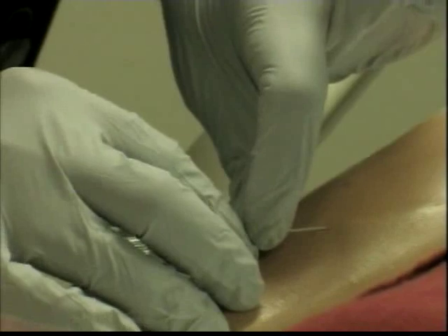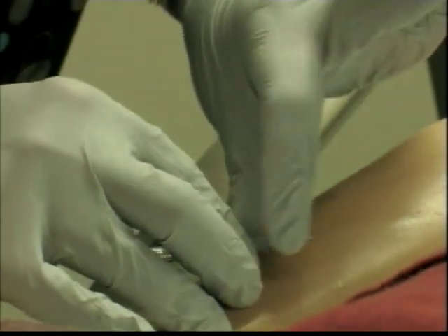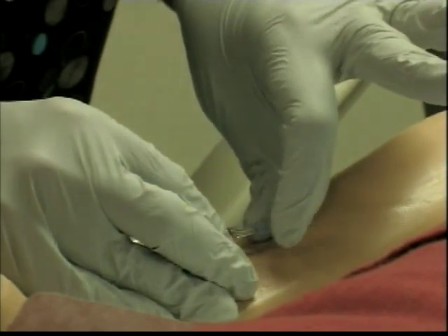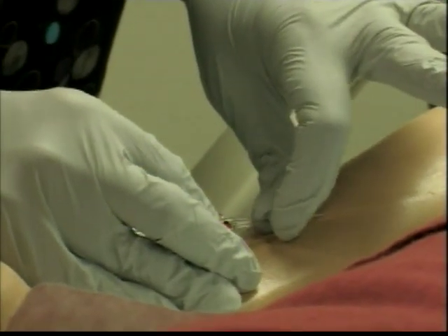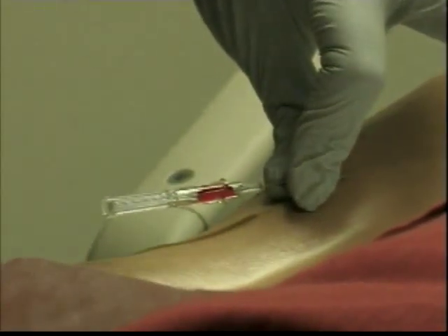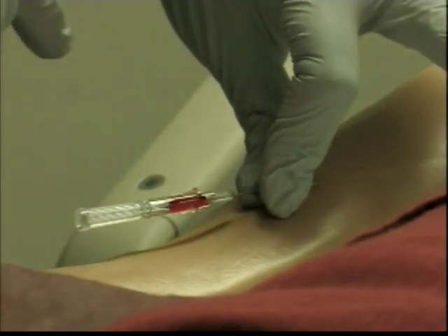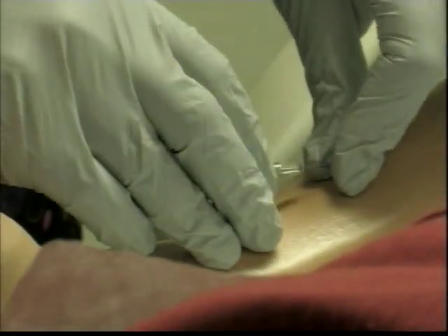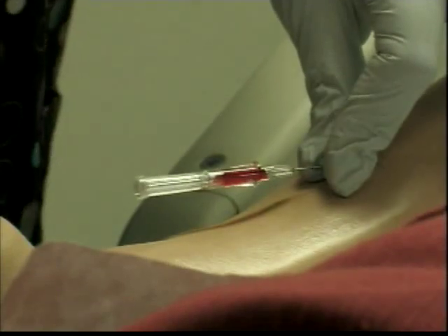Okay, so you will be advancing the catheter at the same time you're removing your stylet. You see that? We keep on doing so until we put the catheter all the way through. Now we're holding steady. You see how my fingers are holding this steady right at the hub. It's not getting contaminated. We remove the tourniquet. We have our thing ready there to go. It's going to be a little bit of blood, but you do it on a sweep motion.